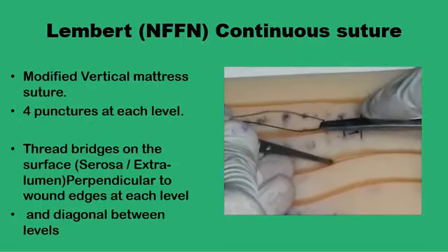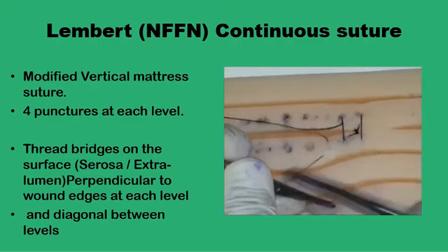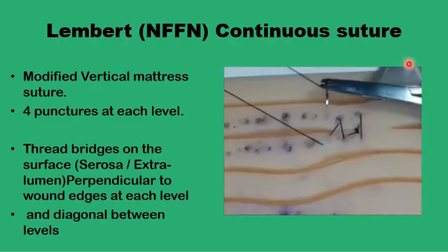Another version of the Lambert, this time near to far, far to near continuous suture.